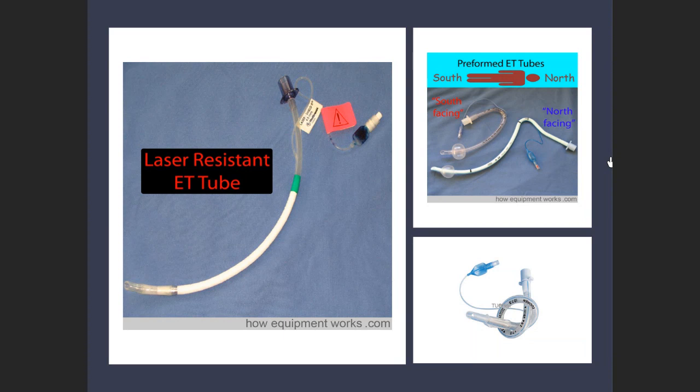You said why would you want to place it down? Yes. Why would I want to put in a tube that is purposely bent down? To prevent choking or for easy removal?